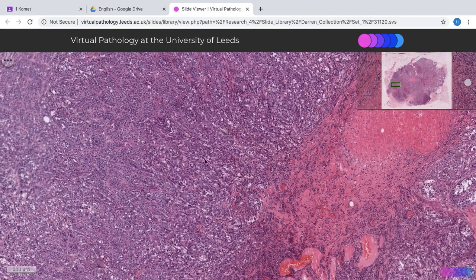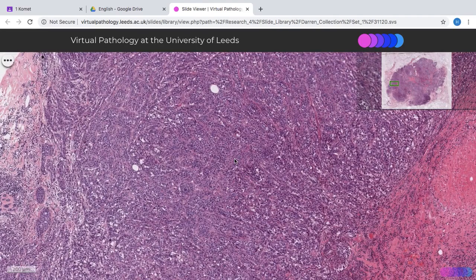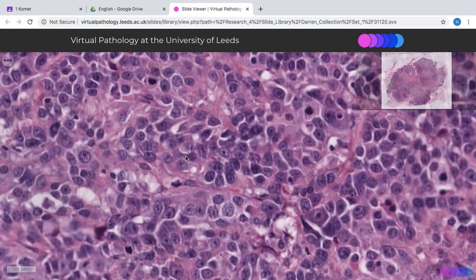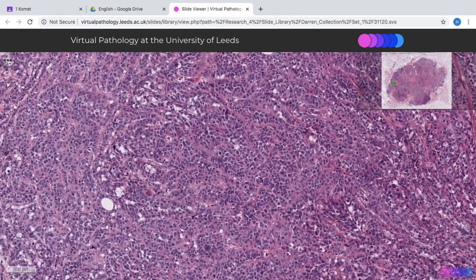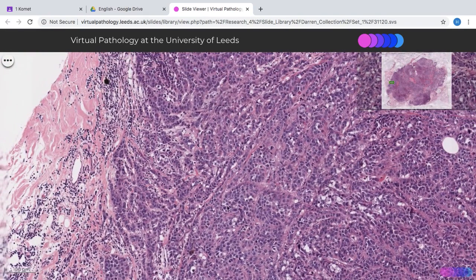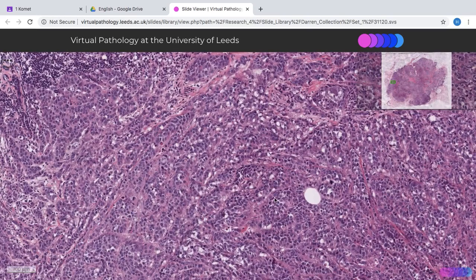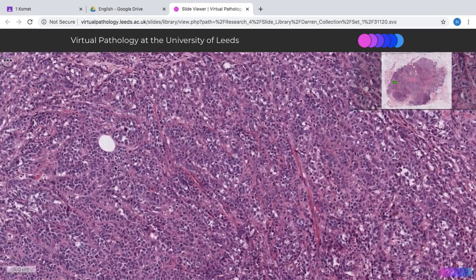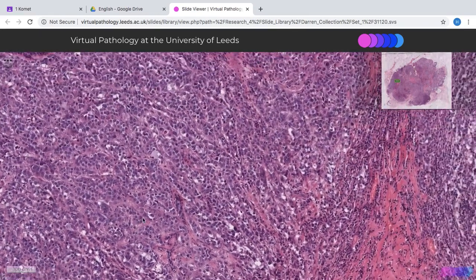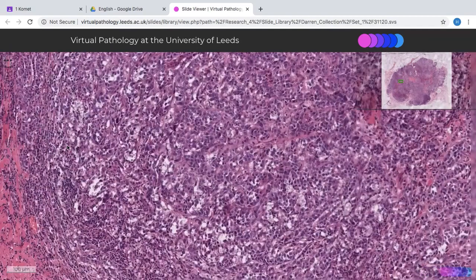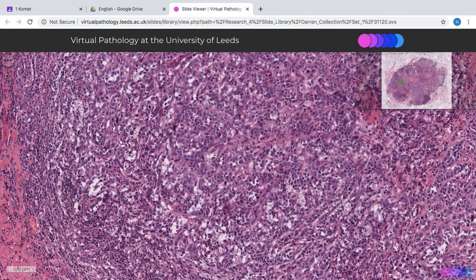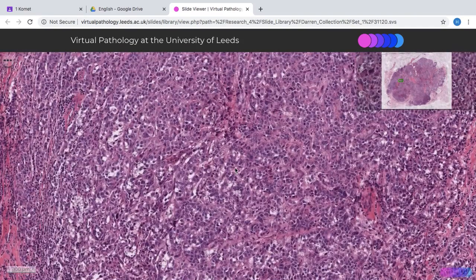In terms of the arrangement of the tumor, you can see quite a variation in architecture. Some of this tumor just forms irregular cords, and then at the edge, again, irregular cords. Some form smaller clusters, and then in areas they seem to be arranged in sort of irregular sheets — just lots and lots of tumor cells.